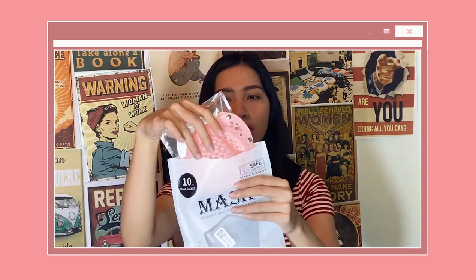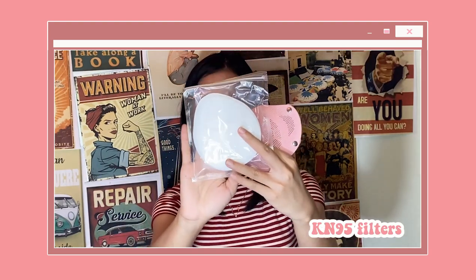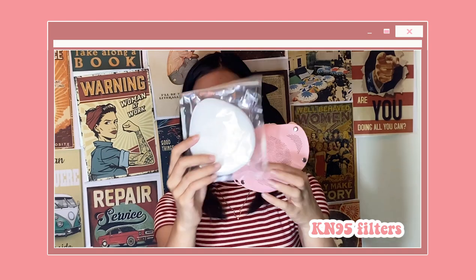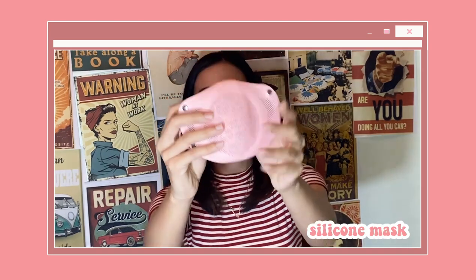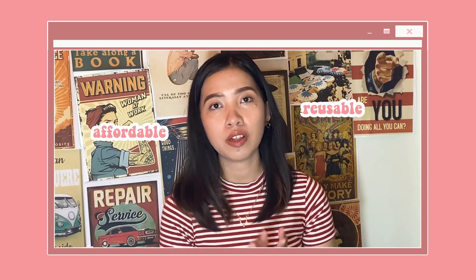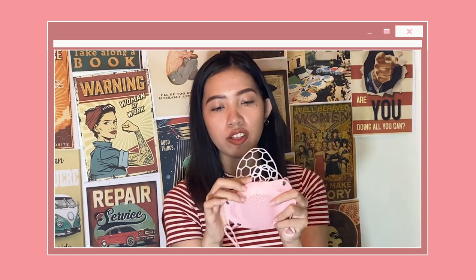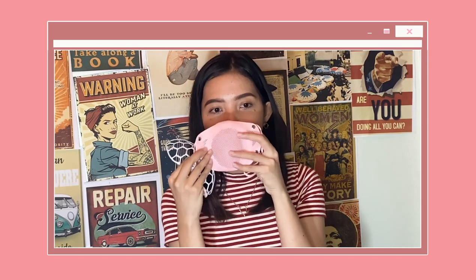When you open it, it has these 10 KN95 filters, the silicone mask itself, and two gaskets to protect the filter. This silicone mask claims to be reusable, affordable, economical, and convenient to use. It is very soft to touch and rubbery, and it does not smell like plastic at all.